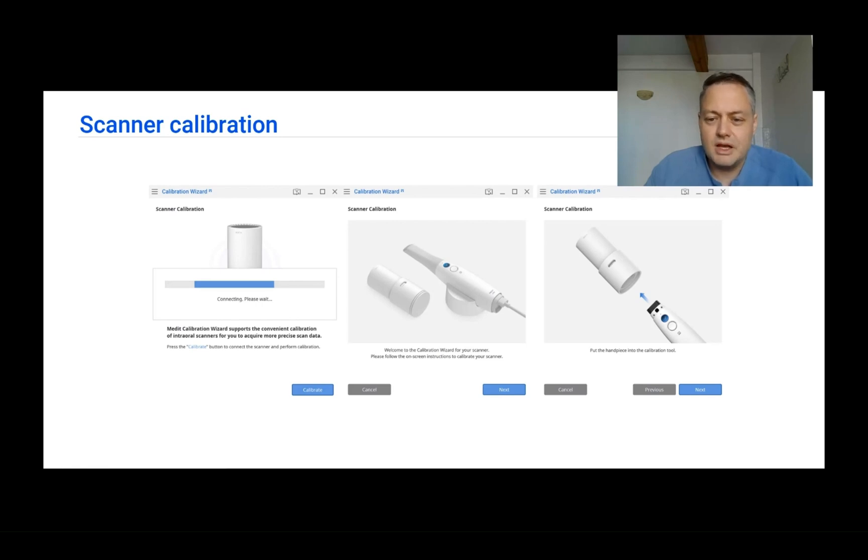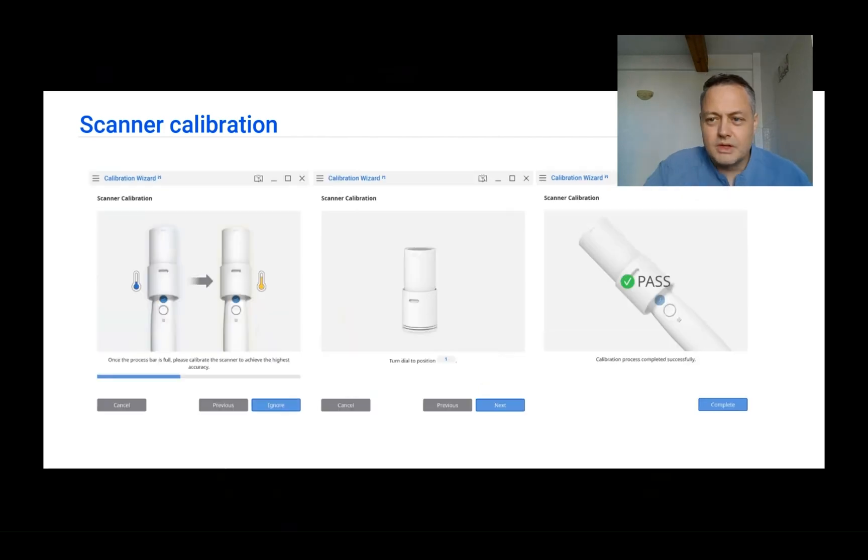You will sometimes get a pop-up message telling you that the scanner is not warm enough. This is very important because physical objects have dimensions that vary with temperature. Let the scanner heat up accordingly before using it for calibration and for general use. Never start scanning if the scanner is not warm enough — let it do its thing, and only after everything is warm enough and it confirms this should you start scanning.